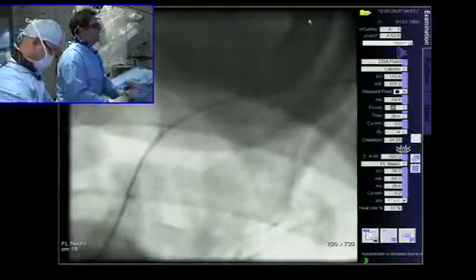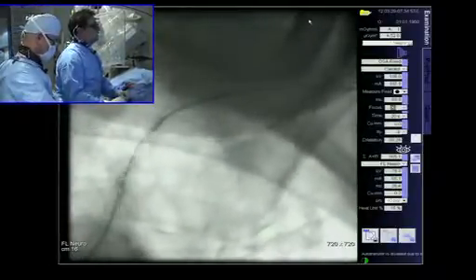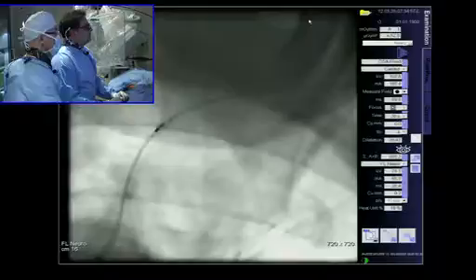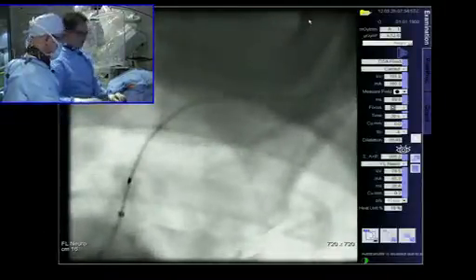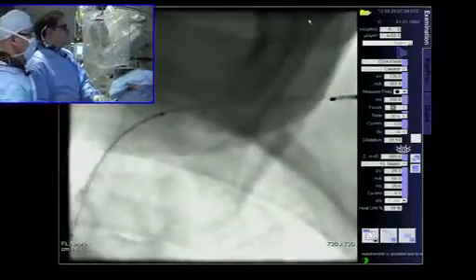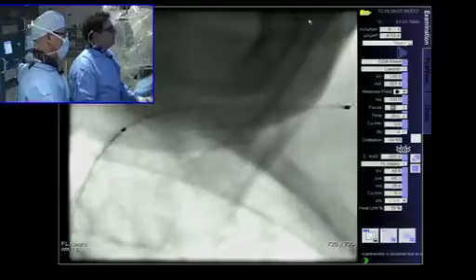It's going to tell me how everything is going to go, because obviously the stents are much bulkier than the balloon, and so you definitely want to be able to learn. See, it's pulling back already. So the question is, what's going to happen? Oh, what's the wire? We're going to be careful with that wire. The question is whether we need to get this wire further out. Sounds like the wire needs to go to the arm. Yeah, it's probably going to have to, George. Distal. And I think that's what we may have to do.